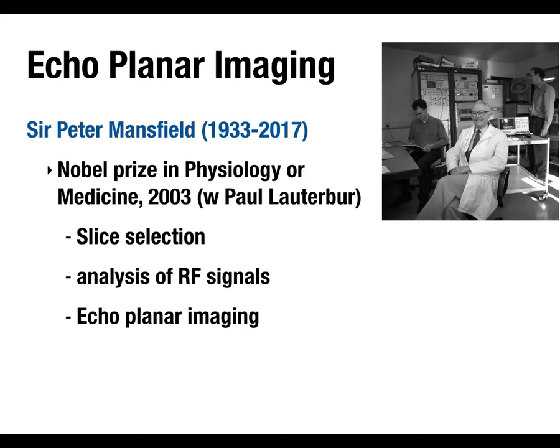And I mentioned, remember last time I talked about the Russian who invented MRI, but nobody believed him and he never got any credit for it. In that article, there was mention of this other guy, Damadian, who felt that he should have shared in the Nobel Prize. And one of the key reasons that he didn't was that his implementation of MRI didn't have gradients. So that whole process of coming up with the gradients to do the spatial localization wasn't part of what he developed, and that was key to the Nobel Prize, and also key to echoplanar imaging.